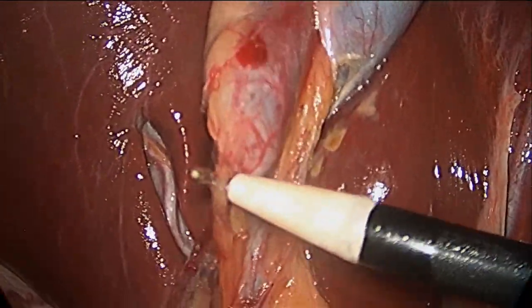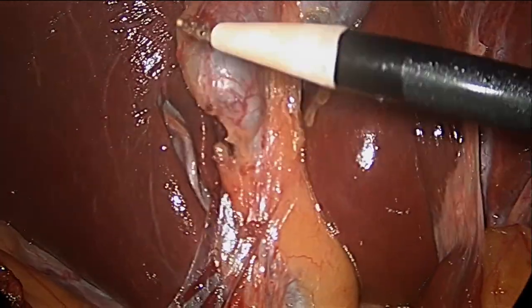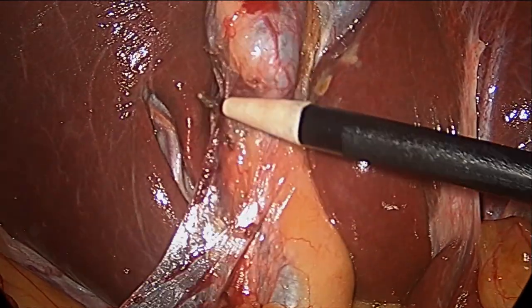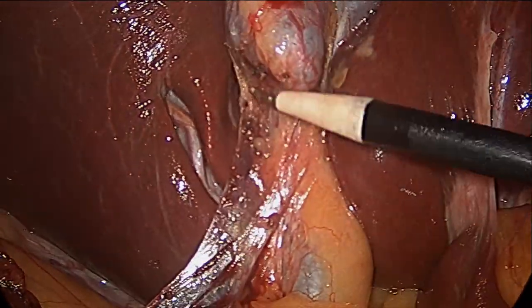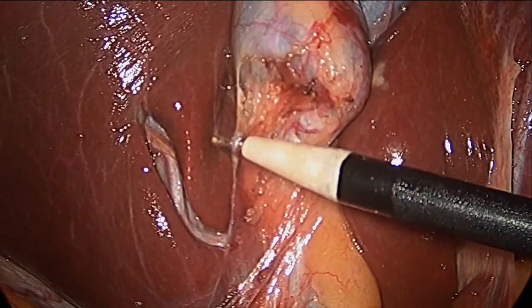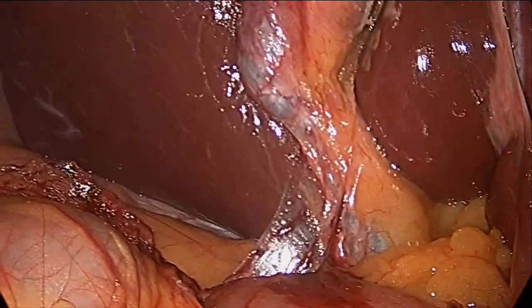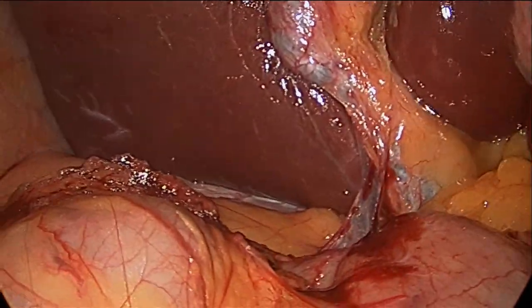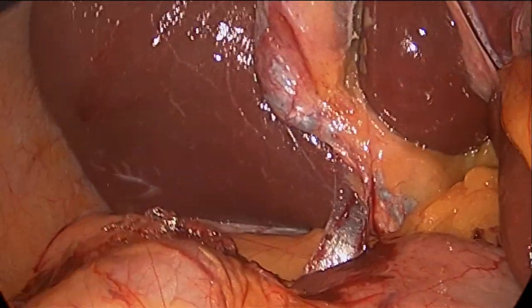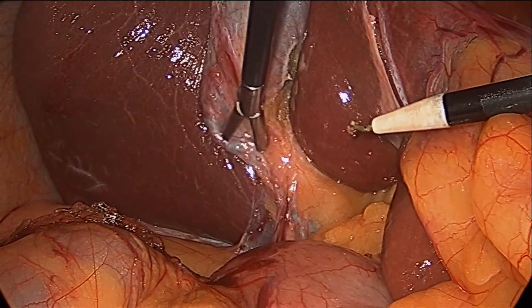The patient is a lady who has had several bouts of gallstone disease. The revision revealed a pronounced adhesion process in the gallbladder region. We performed adhesiolysis and began to isolate the gallbladder structures, starting dissection of fibrous and adipose tissue along the posterior, anterior, and lateral circumferences of the gallbladder.